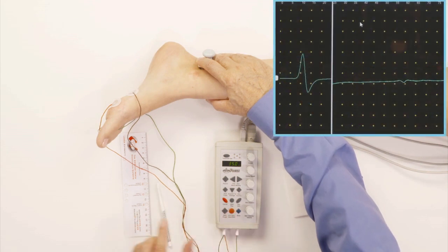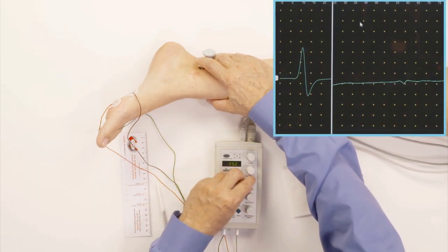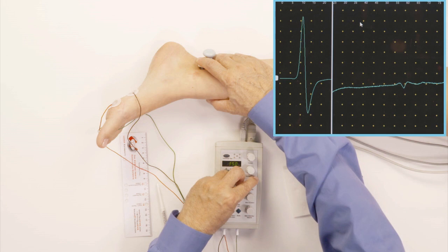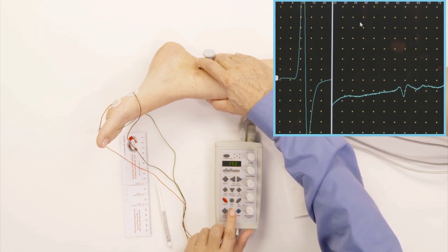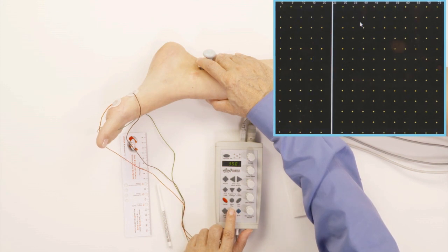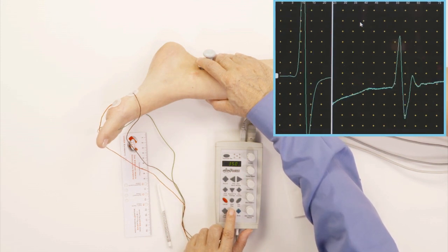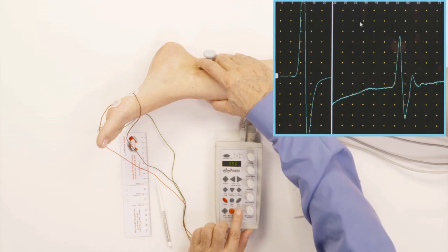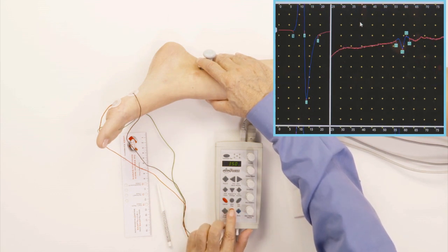Now I got it. You see the beginning of the F wave here, right there. Here's the F wave. I accept that. Now that's the next one. That's a wonderful F wave. You don't get them like this too frequently. I accept that.